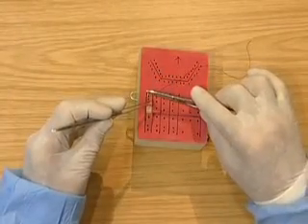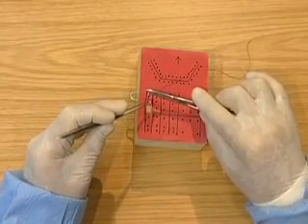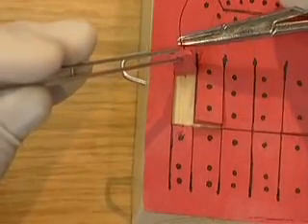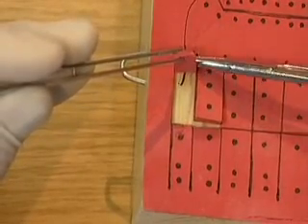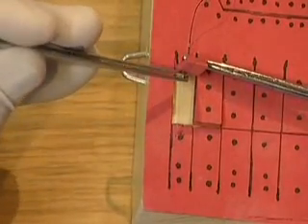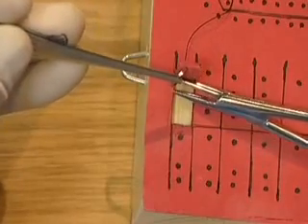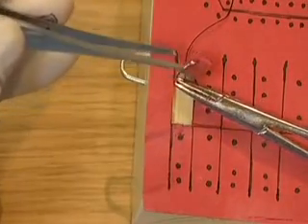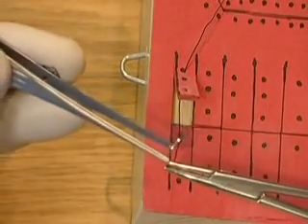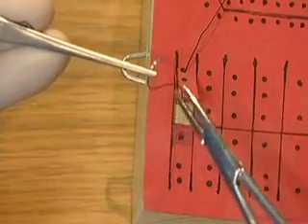Pick up the flap with the tissue pickups. Insert the needle through the furthest hole in the flap. Take the needle with the tissue pickups, then take the needle with the needle holders one third from the swaged end. Correct the needle grip so that the needle is at right angles to the needle holders.